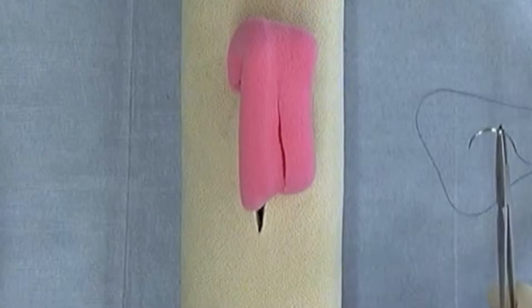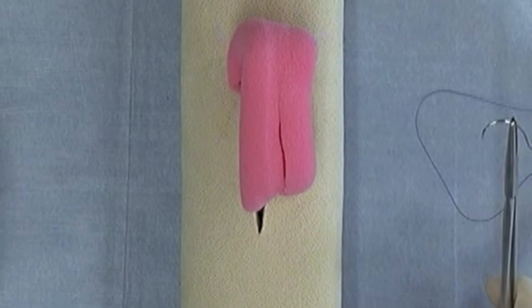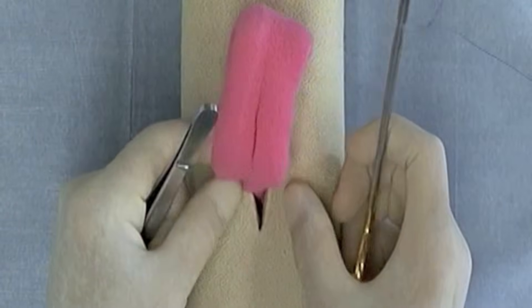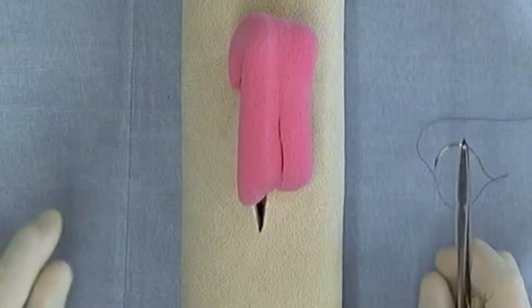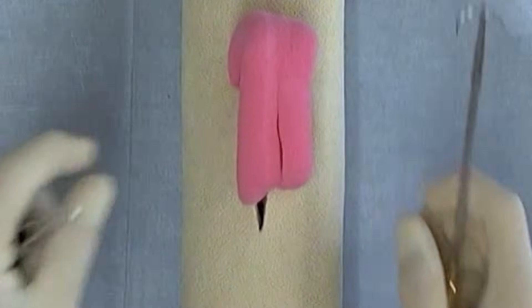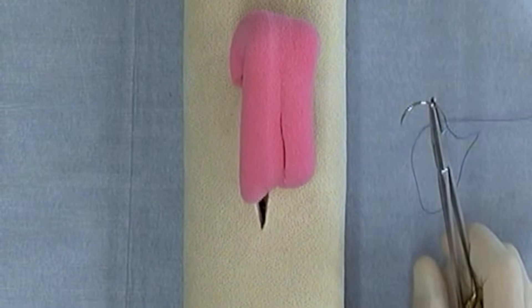The Lembert, the Connell, the Cushing are all inverting suture patterns, and so they're very difficult to practice on the skin portion of the daisy. Much easier to practice on the intestinal portion of the daisy.